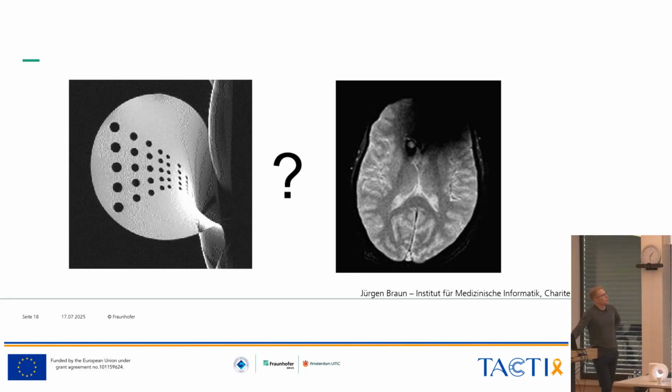Yeah, so the air tissue interfaces are usually a problem which will introduce these geometric distortions like before, because as you said, usually in those areas you will have these really high local deviations from the main magnetic field. In this case, it's even worse. So this is some type of susceptibility artifact. So there you would usually have some sort of metal inside your system, which will introduce a large change of the main magnetic field.